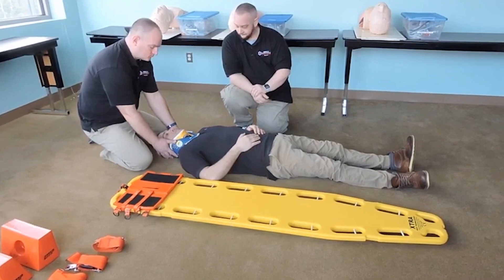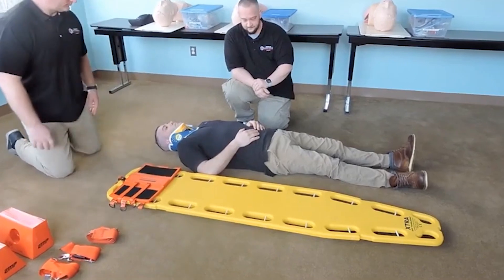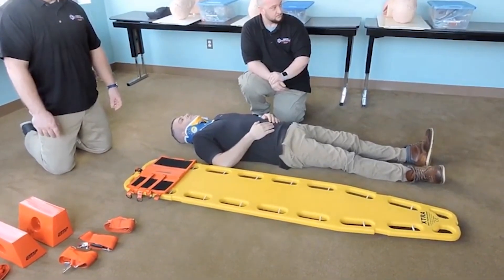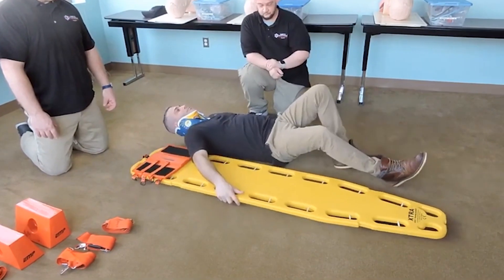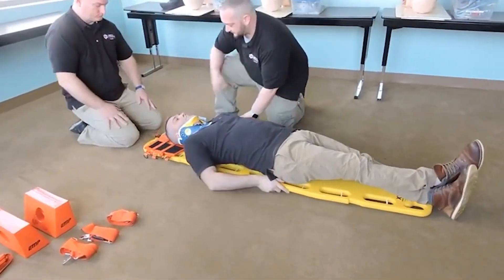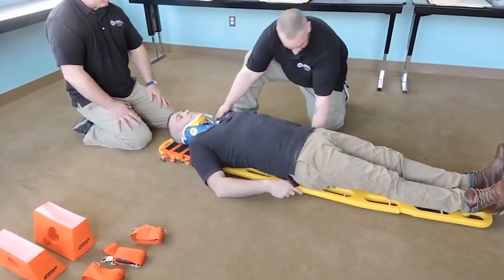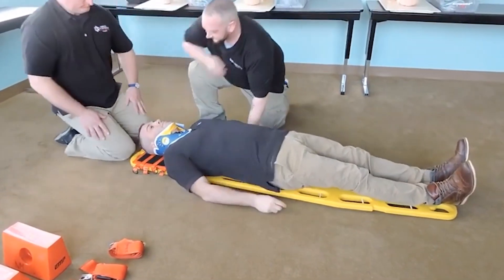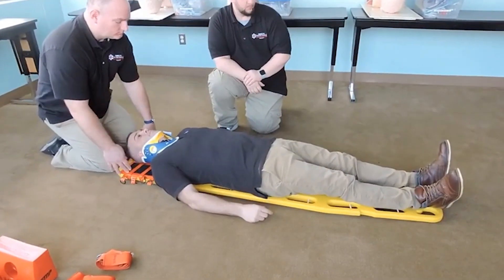Your partner can let go of stabilization, slide onto the board, and adjust the patient up or down however you feel appropriate. When you're comfortable with where your patient is on the board, your partner can take up stabilization again. Scoot up — let's move you head to be a little more centered. My patient is now positioned where I like him on the board.